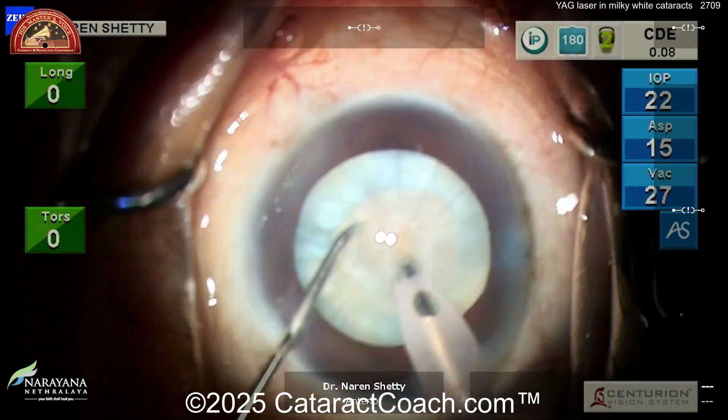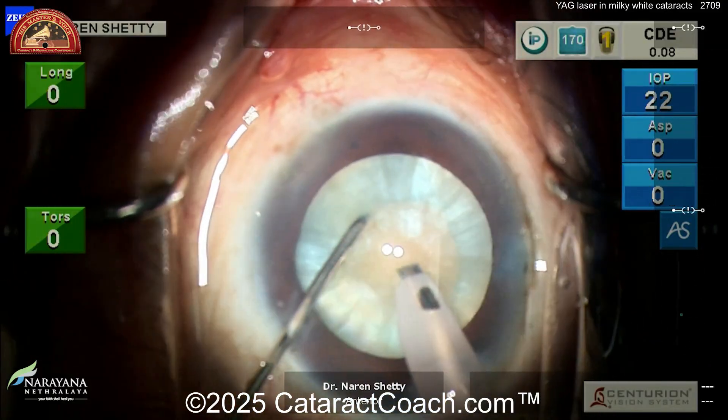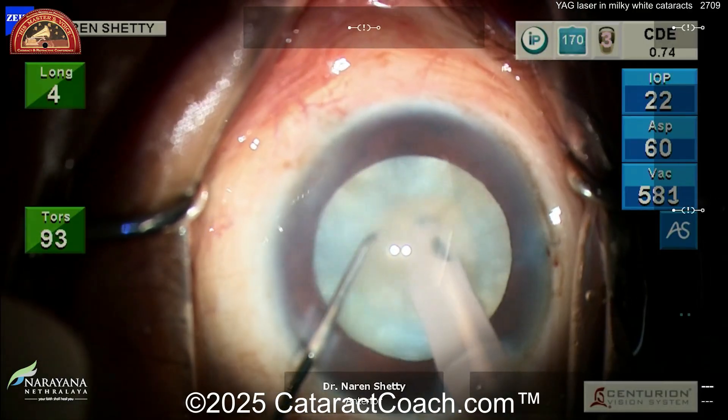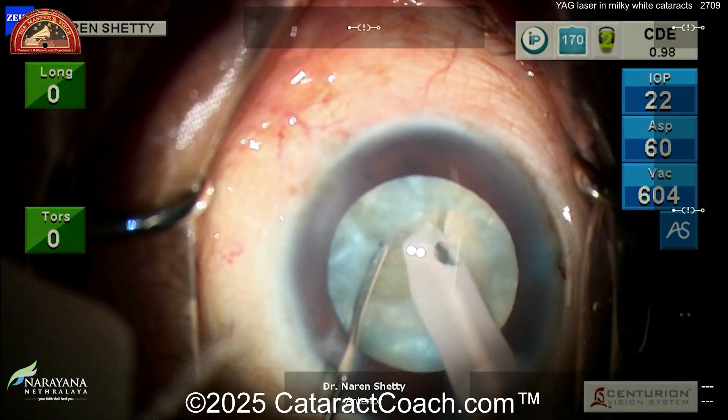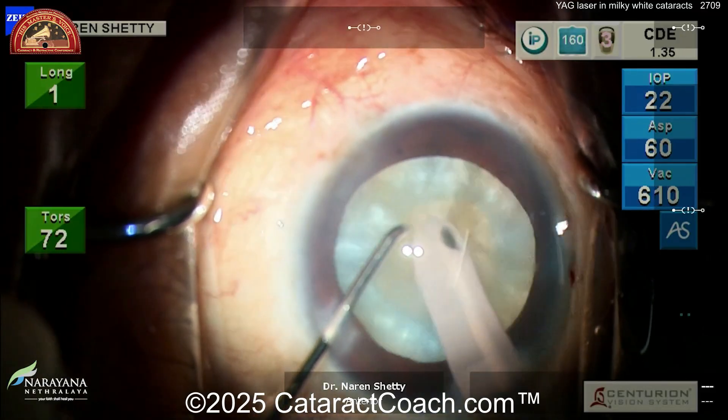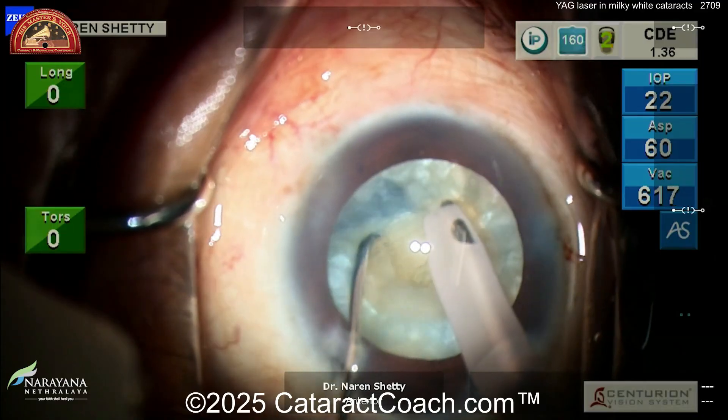At this point you've got a beautiful REXs done. You get the phaco probe in the eye — here's that white cataract. Buzz into it, get a little vertical chop in here, and separate this nucleus up into small pieces. The rest of the case is pretty straightforward. Once you have a nice REXs, the white cataract isn't quite as challenging.